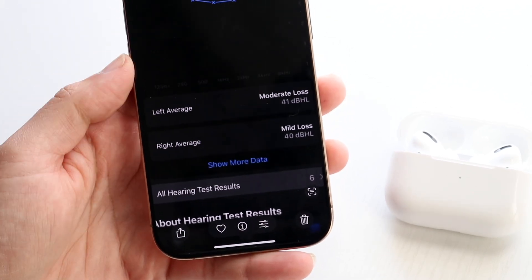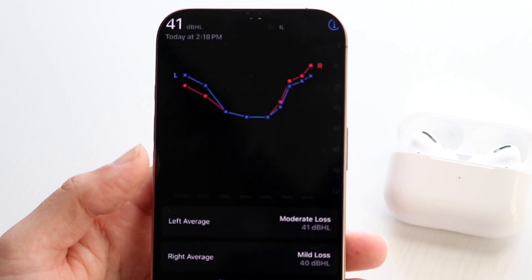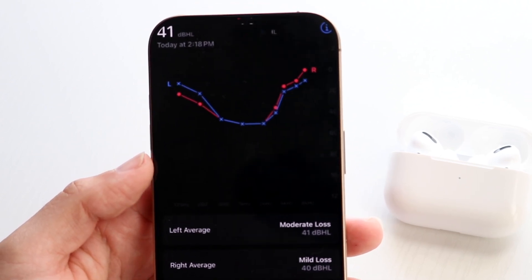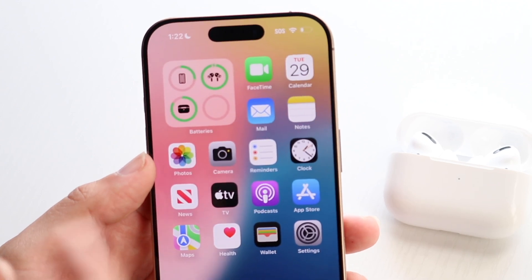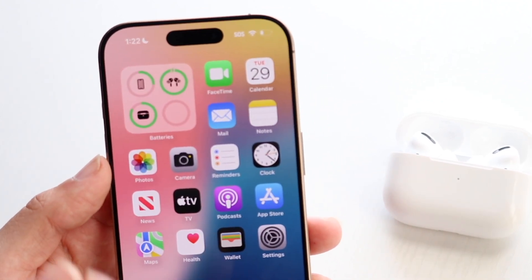It's going to give you a breakdown of how good your hearing health is and show you that information at the bottom. At that point, you should be good to go. You can now start using your AirPods as hearing aids within those apps. You can go ahead and enable them, and I'd recommend adding a Control Center toggle for hearing assistance.